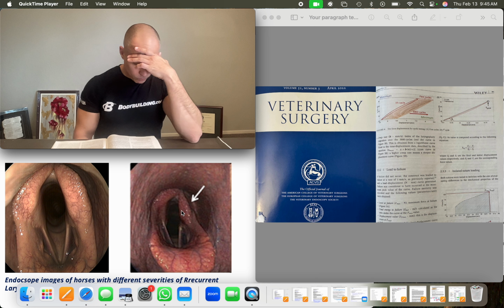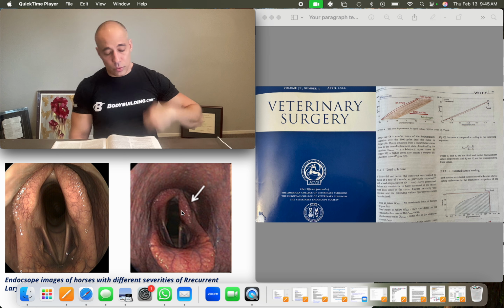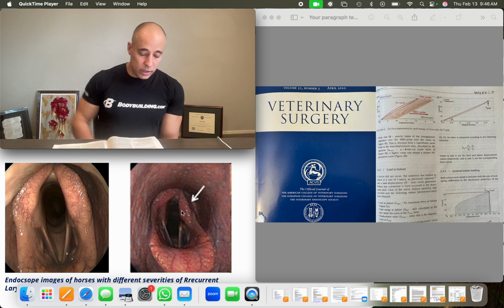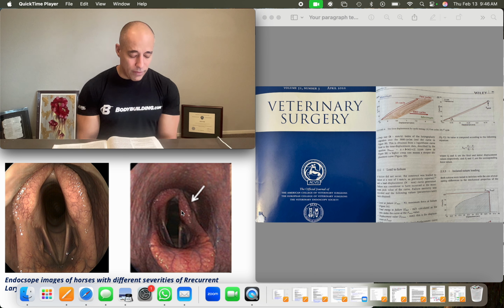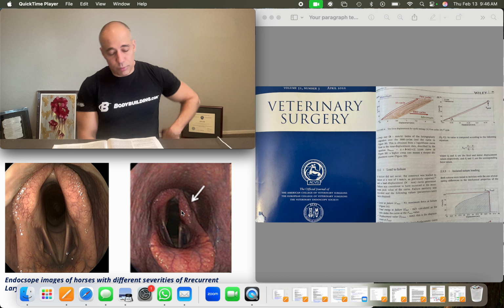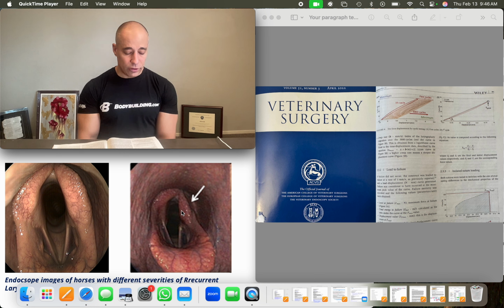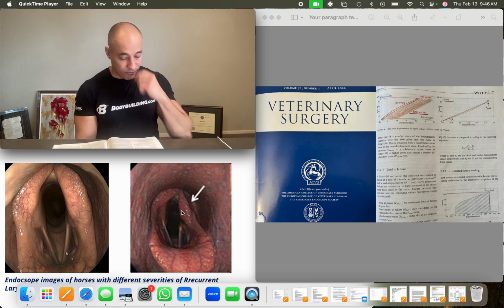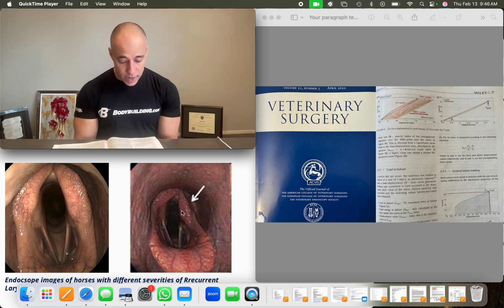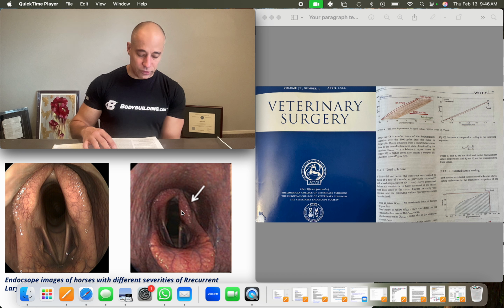I will go to this part, failure of laryngoplasty. So with the ethibond group, the constructs failed due to cutting through the muscular process. And in one case, the suture broke far from the knot. Eventually, all the Tiger tape specimens failed due to muscular process cut through. The ethibond with a cannula failed due to breakage of the suture on the cricoid button, except for one case in which the suture broke randomly but far from the knot. Finally, the Tiger tape cannula specimens failed due to random suture failure or failure of the muscular process.